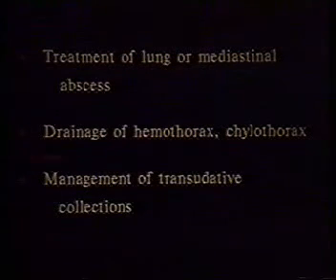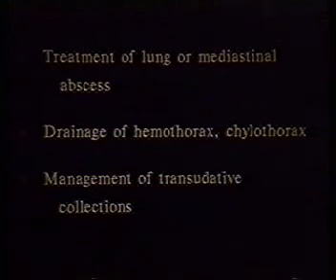On occasion, there will be a patient who has a post-traumatic hemothorax or chylothorax who will be presented for percutaneous drainage. And then there are a number of patients who have unexplained or explained transudative effusions in whom repeat thoracenteses do not seem to eradicate the effusion and who will proceed to percutaneous drainage and perhaps chemical pleurodesis.